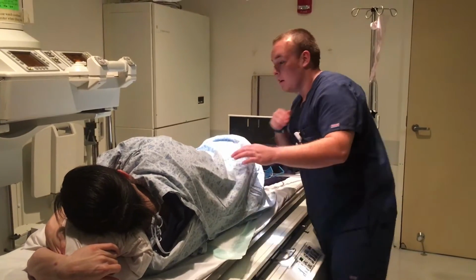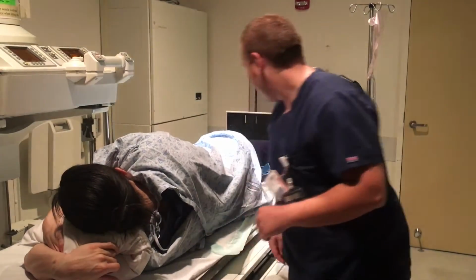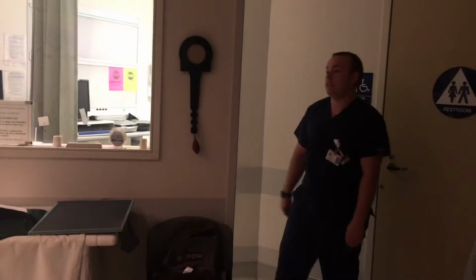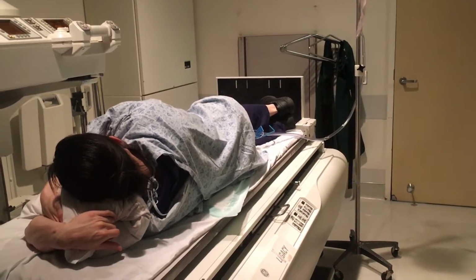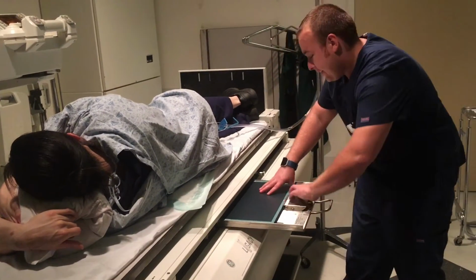Alright. Looks good. Got my marker on there, yep. Alright. Technique's going to go up to 90 at 60. Taking a deep breath. Blow out. Hold. X-ray. Alright, go ahead and breathe. Scan this one.